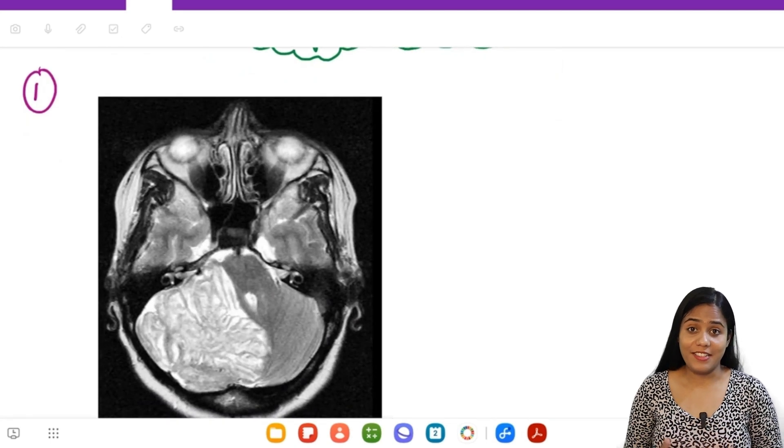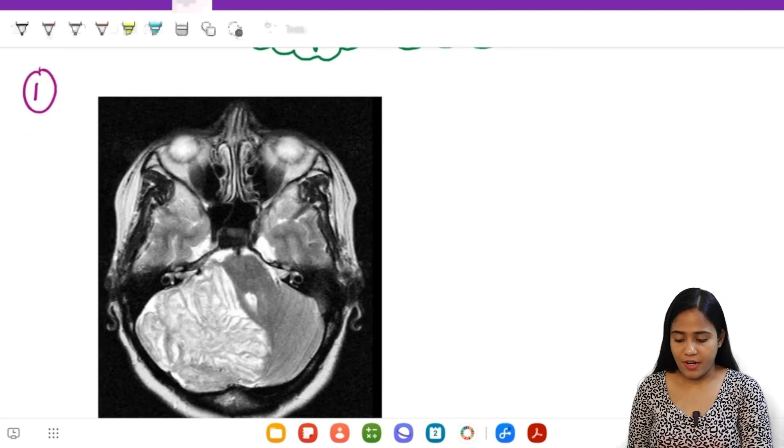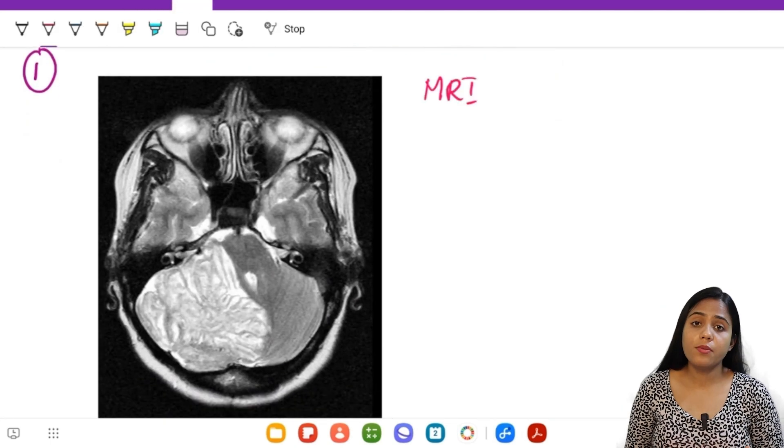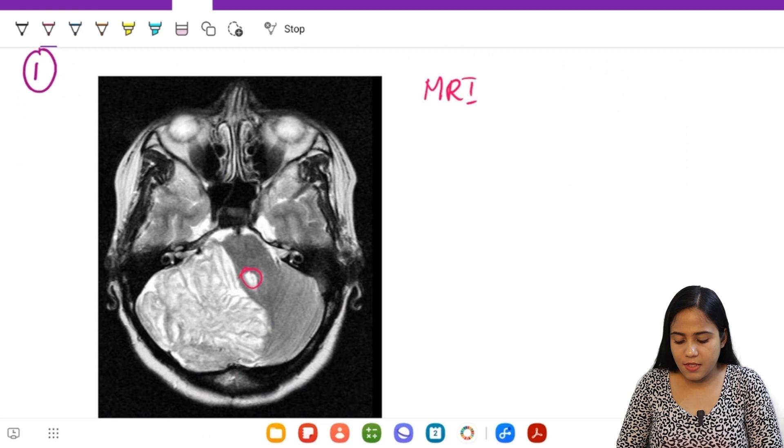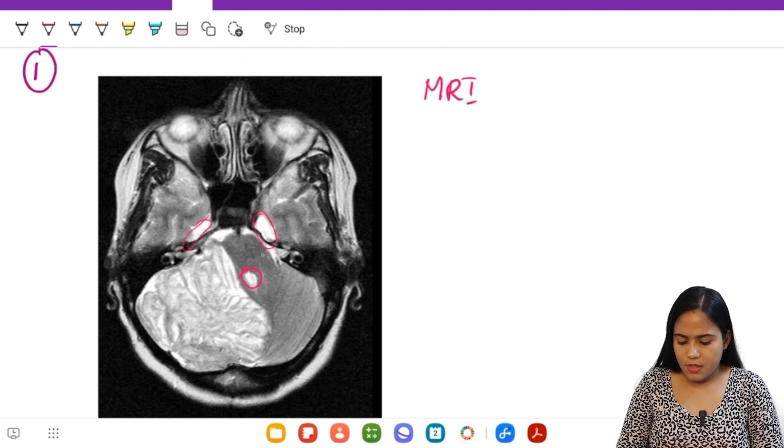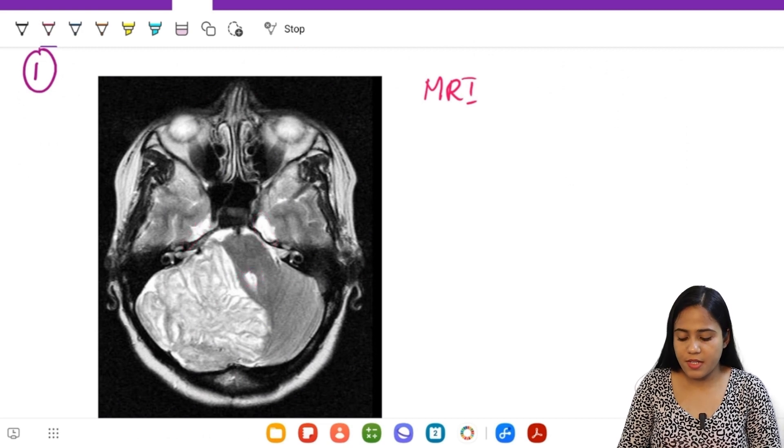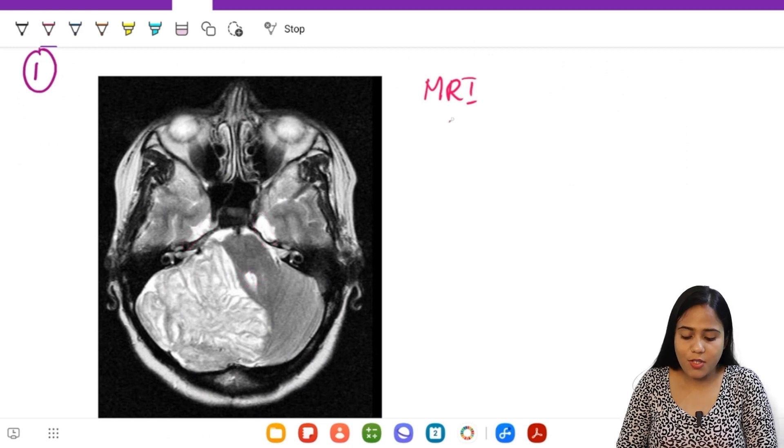Hello everyone, let's get started. We can very well see that this is an MRI T1/T2. You can see this is the fourth ventricle, these are cisterns, all of which appear to be hyperintense, so this is a T2 of the brain.